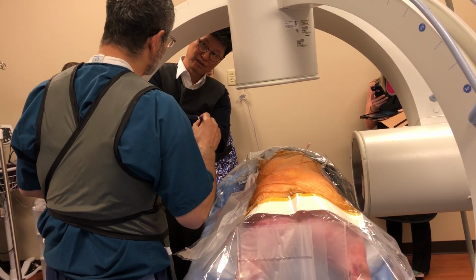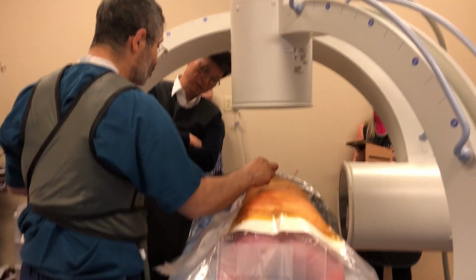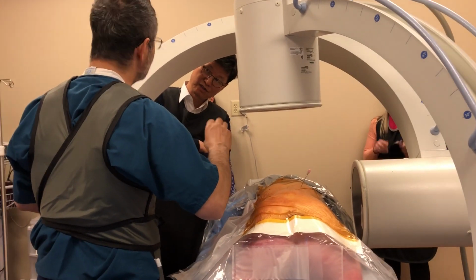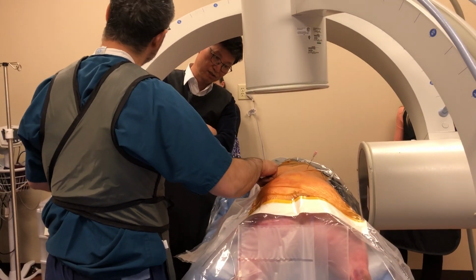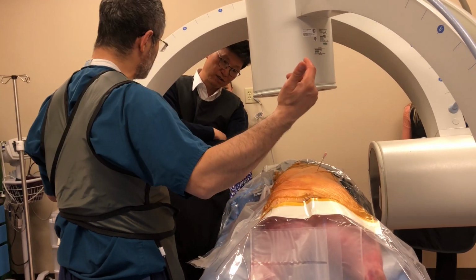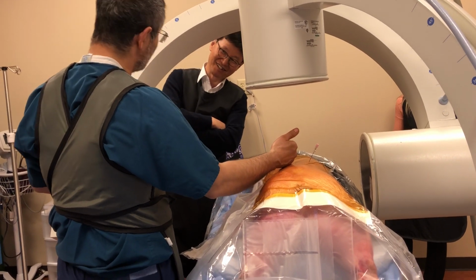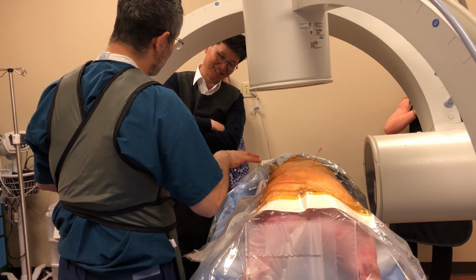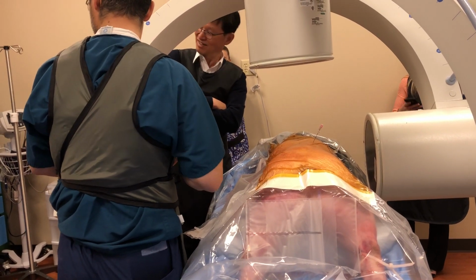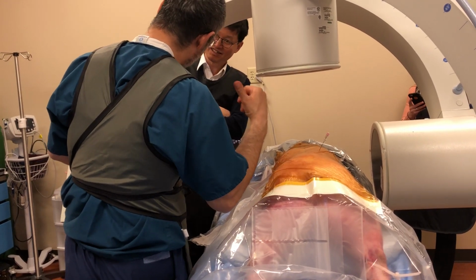When you are far lateral, as described in literature, you can go to Kambin's triangle if everything is perfect. Here, you can go to Kambin's triangle no matter what, because no facet hypertrophy can be that far lateral to put an obstacle on your way, because you're anterior to the transverse process. You are absolutely right. Anterior to the transverse process. You are actually here.